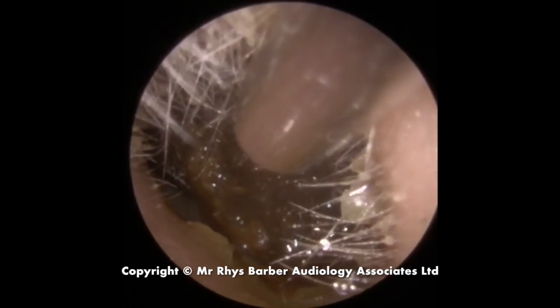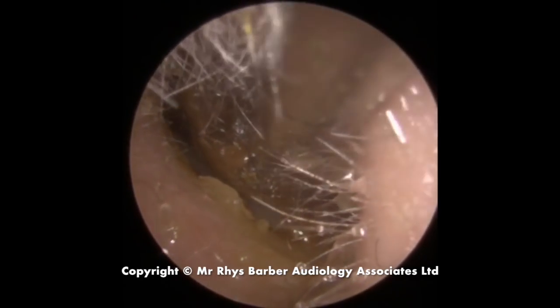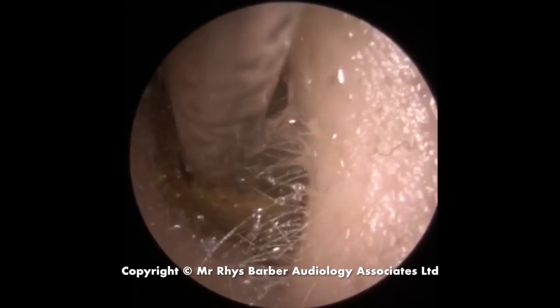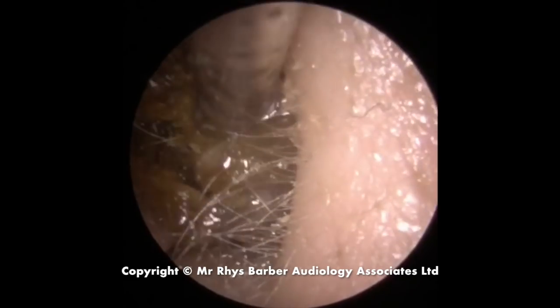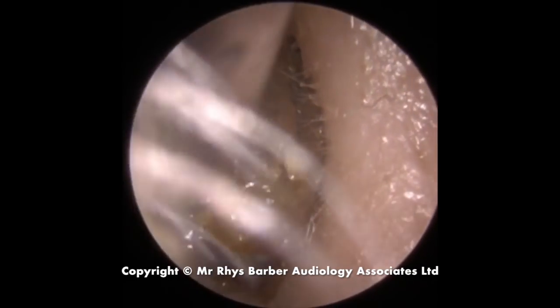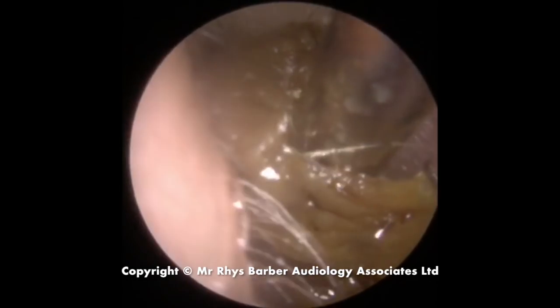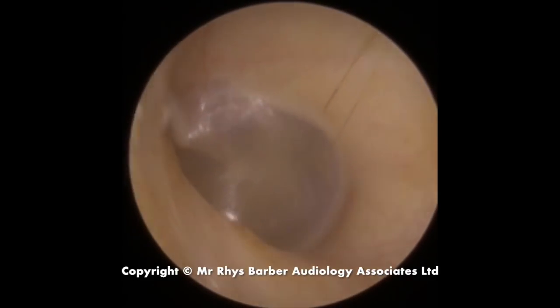This looks like a much larger piece. Just put a little bit of olive oil in there because it looks quite dry, so it helps me to get a better suction grip on the wax itself. Really just wiggling this wax up and down, back and forth, to work it around the bends in the ear canal. There we are, you can see it just starting to work its way out now. There we go. And that came out in one piece. You can see a lovely shiny eardrum there.